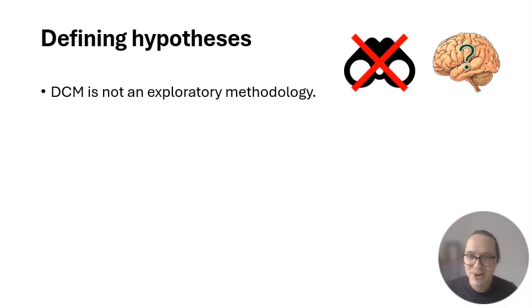Just to hammer this point home, DCM is not an exploratory methodology. You shouldn't go in with a group of regions without a specific idea of what question you're trying to answer, and just run a DCM and find some differences, because it will give you an answer. It will be optimized to try and give you an answer that makes sense. But if you don't structure your question well, then the answer you get out is not going to be particularly informative.